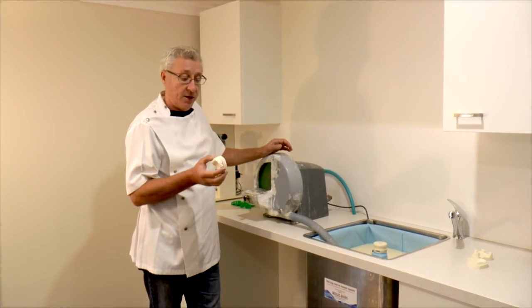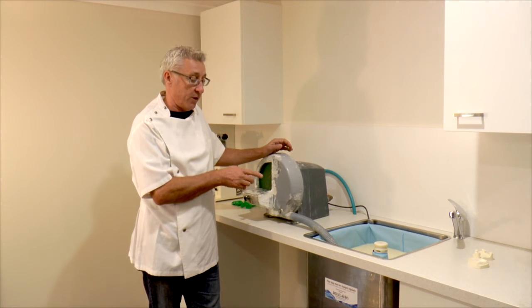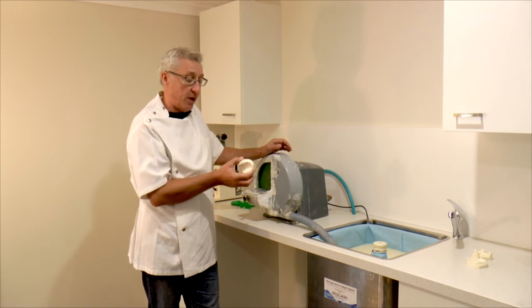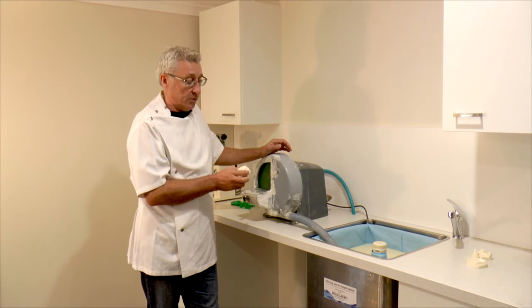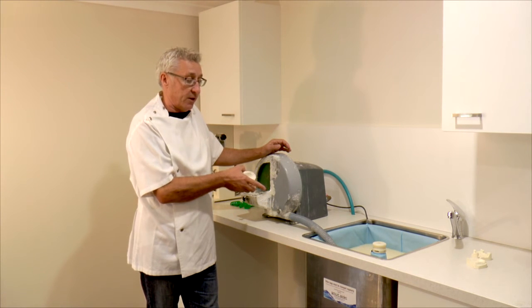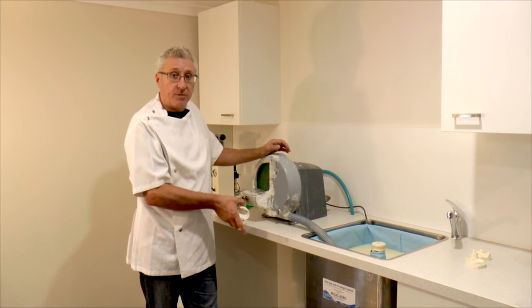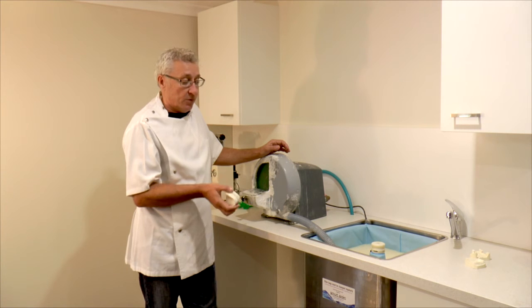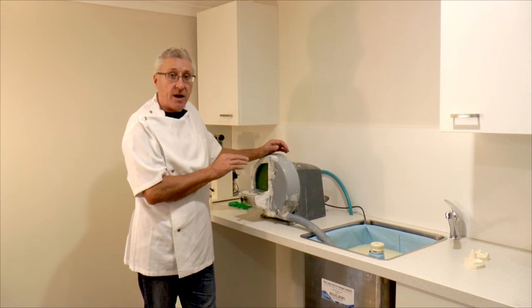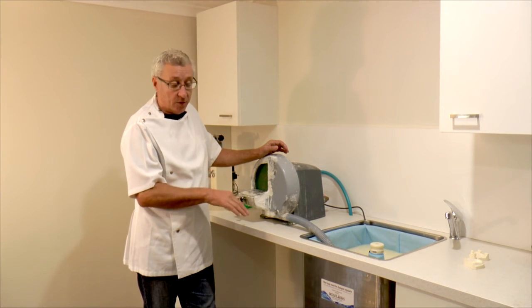What you've just seen is the trimming of the stone models. This is all the waste water that goes into the sink from the grinding of the models — plaster and stone. Generally, they're the two materials we use. All the waste goes into this sink. And in the old days, all that went straight down the pipe and into the system. By the end of the day, the slurry would set hard like concrete in the bottom of the sink and also the pipe.